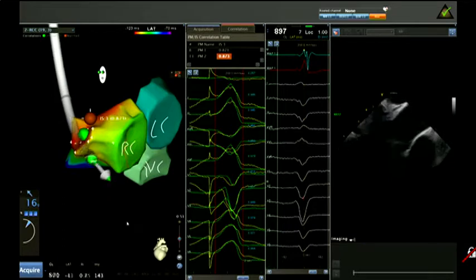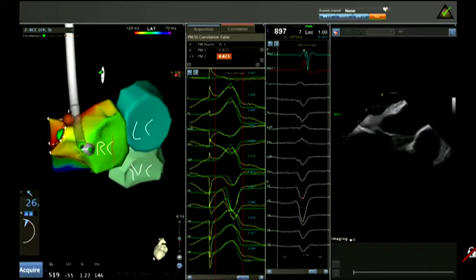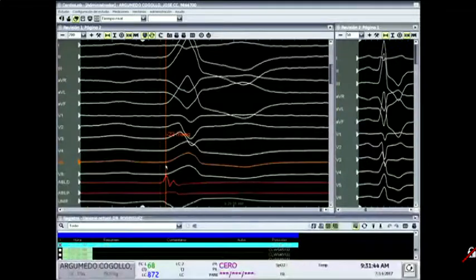Okay, can we see the CARTO screen of PRUCA on the main screen so that we can show that screen to the audience? For the time being, what we are doing is the activation mapping of the extrasystole, which are now more frequent. This is one of the last extrasystoles, and you can see the electrogram, the unipolar electrogram.